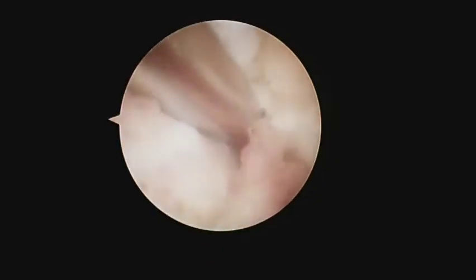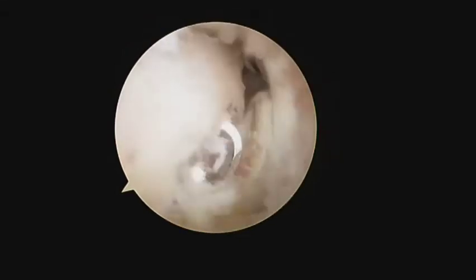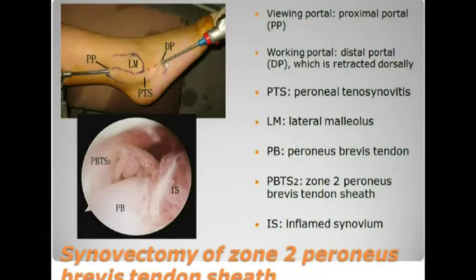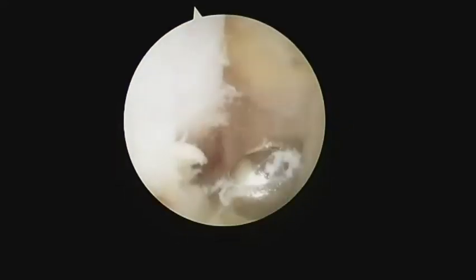Both the tendon and the tendon sheath should be examined carefully for any inflamed synovium, and all inflamed synovium should be resected. This is followed by zone 2 peroneal brevis tendoscopy by advancing the arthroscope to the zone 2 peroneal brevis tendon sheath. The shaver is inserted through the distal portal and complete synovectomy of both the tendon and the tendon sheath should be performed.